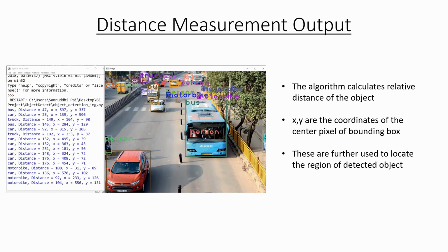The objective of taking only the object that is closest to the person was to avoid excessive noise, and if we keep on giving audio output for each and everything that is being detected, then that would irritate the person. So we choose only the object that is closest to the person.